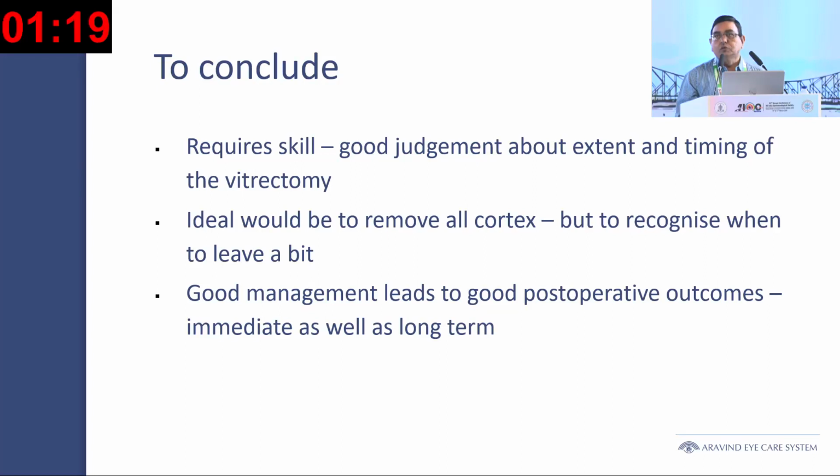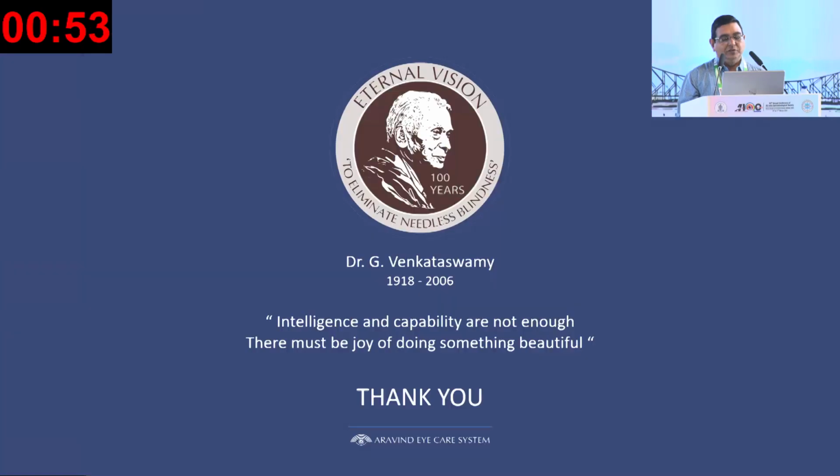To conclude, it requires skill, and more so a good judgment about the extent and timing of the vitrectomy, when it is needed, and how to remove the cortex. Ideal would be to remove all the cortex, but having said that, it is good to recognize when to leave it a bit if you feel that the PCR is likely to extend. In short, good management leads to good post-operative outcomes in the immediate post-operative period as well as in the long term. Thank you very much.